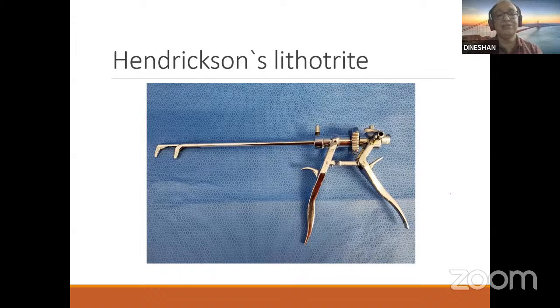And sometimes these two jaws, unless you tighten these two screws very tight before introducing, may get dislodged, and sometimes it may become very difficult to remove it. This is something you must just know, what exactly it is.